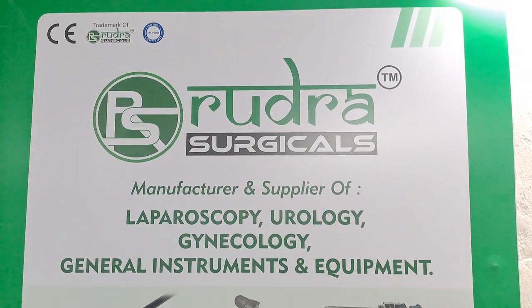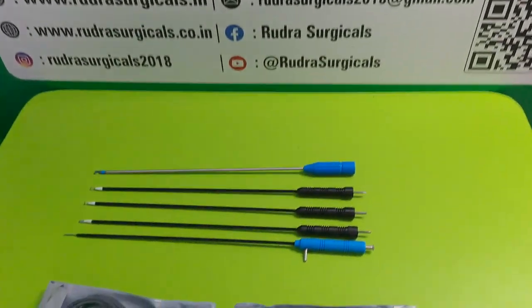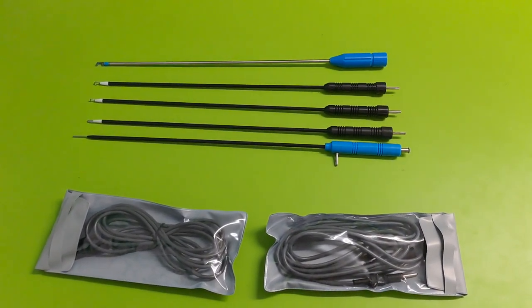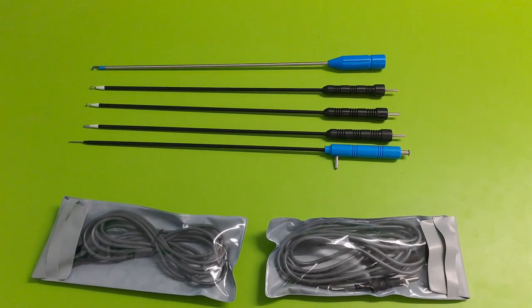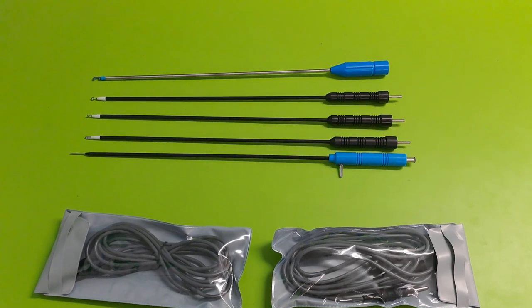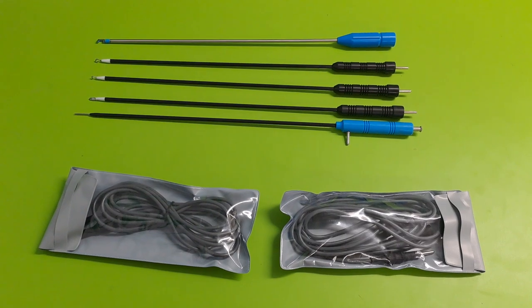Hello, welcome to Rudra Sajjigal. Today I am showing you the L-hook spatula, J-hook aspiration needle, and bipolar electrode.